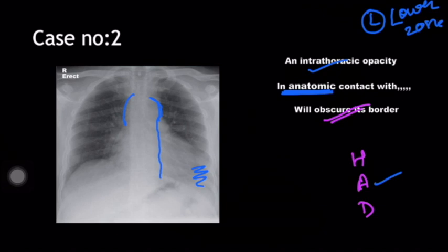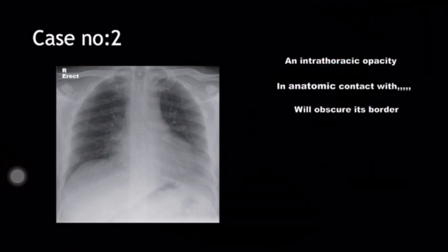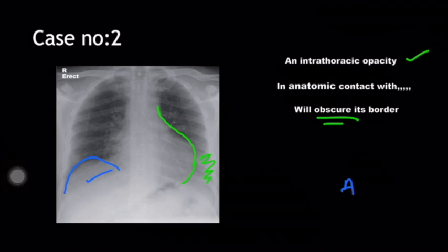What about the heart? The right heart border is intact. What about the left? Look carefully — you can make out the left cardiac margin through the radio-opacity. The right diaphragm is intact. The aorta is intact, the right heart border as well as the left heart border is intact. Can you make out the left diaphragm? Not possible — you cannot make out the left diaphragmatic outline.